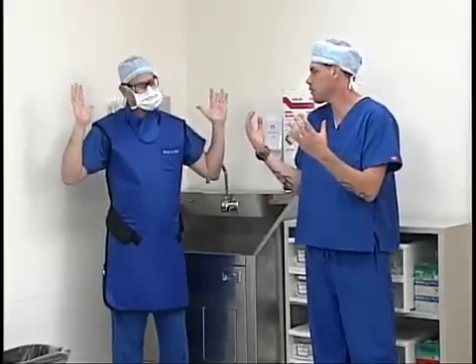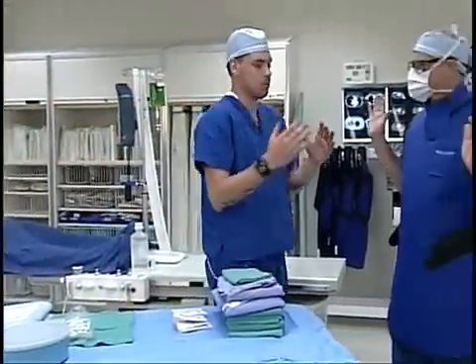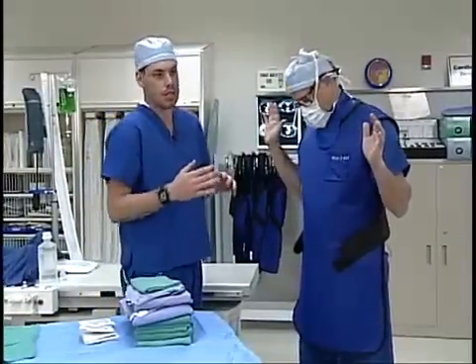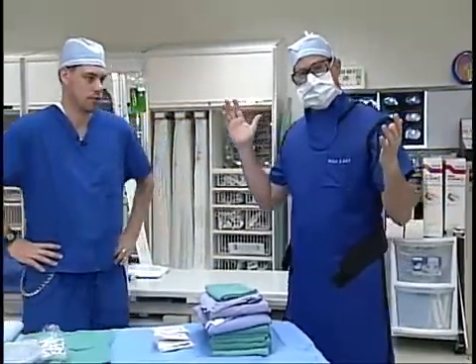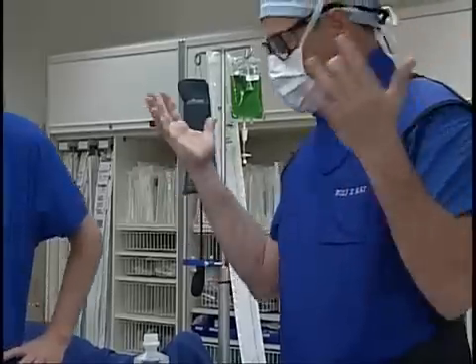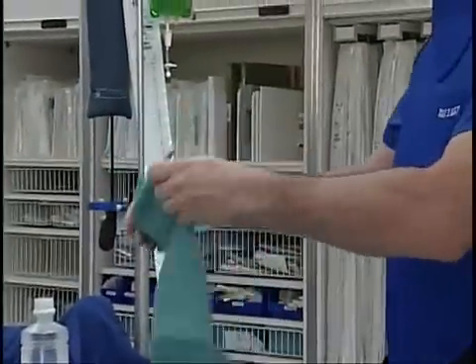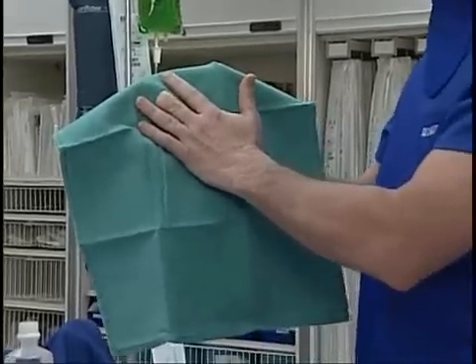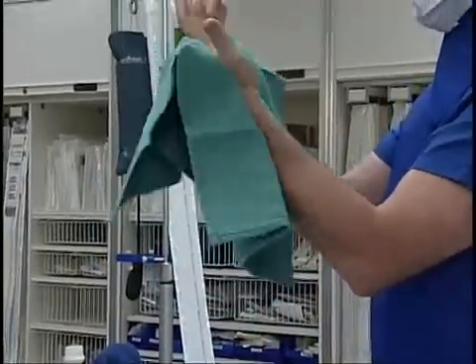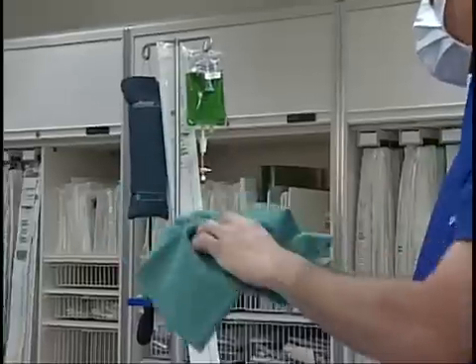Now Scott's hands are considered sterile so he cannot touch anything that is not sterile from here on out. He's going to maintain his arms in his sterile field. Notice Scott has his arms up when he came into the room — his sterile field is only between his waist and below his neck, basically any part of the body you can see yourself. By keeping his hands in the air, any water drips off his elbows so as not to recontaminate his hands. He'll reach and take a towel off the field, and once that towel has touched his hands he may not throw it back on the field or he would contaminate it. He'll dry his hands one at a time with each side of the towel so as not to cross-contaminate.